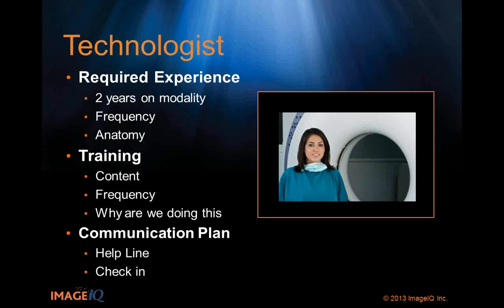In your documentation, you'll want to specifically mention things on training, like not only the content of the training, but the frequency. If this is your 25-year trial, maybe you want to do annual training refreshes. If it's your 6 weeks, probably not. Even in a 25-year trial, you're going to have employee turnover, people moving, scanner upgrades, we'll talk about that later, but you need to have a plan documented on how frequently people need to be trained. Otherwise, you're going to find that 2 years goes by, and all of a sudden the quality of what you're getting is going to hell in a handbasket.